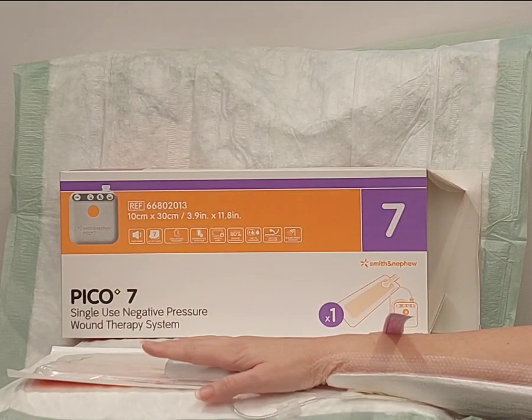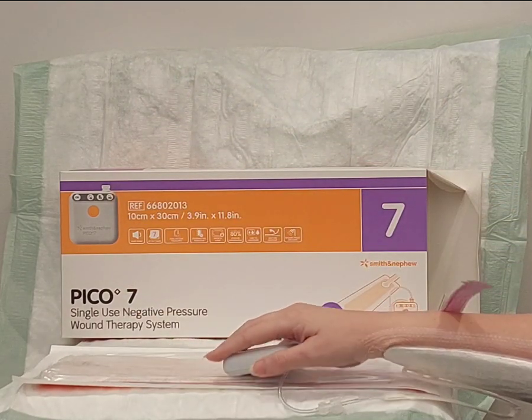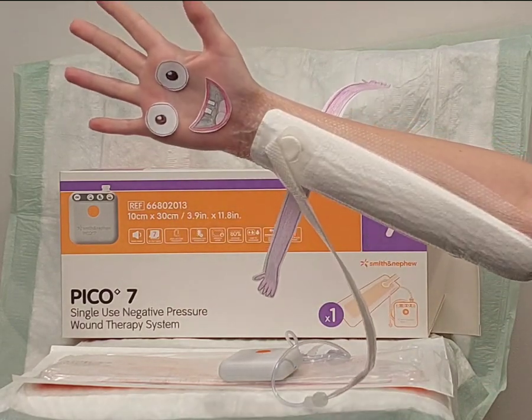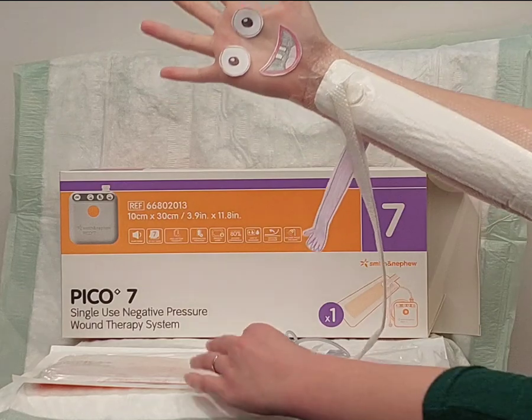Removal is really easy. The silicone backing makes removal atraumatic. And when disposing of the Pico, please ensure the batteries are removed and disposed of separately.